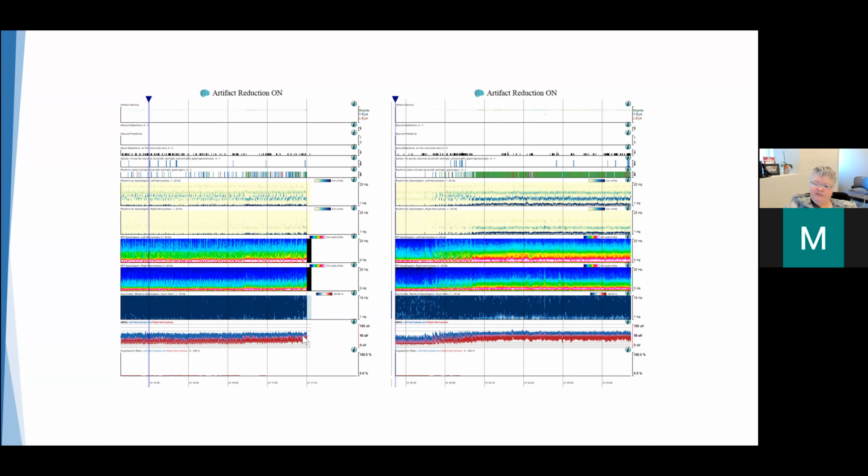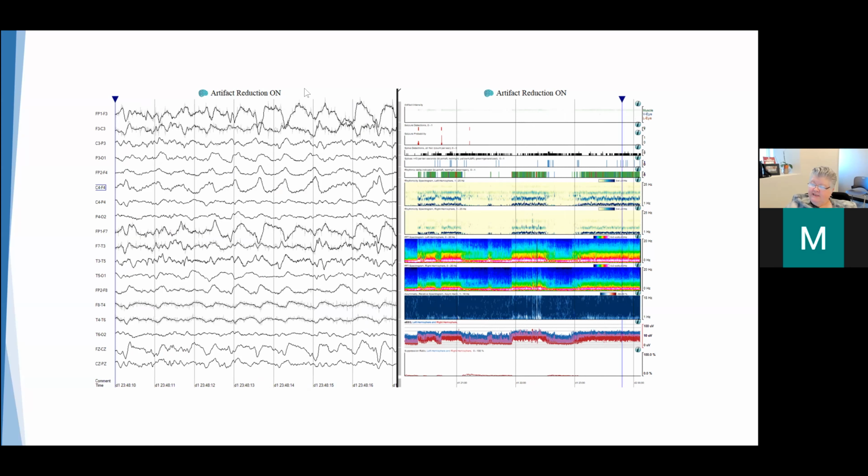If we look at what's going on in the raw EEG, we see increases in delta activity, so focal slowing over the left frontal and left frontotemporal region, some sharply contoured discharges here. And these changes, this rhythmic delta activity, occurred in bursts over time. Whenever the patient was stimulated, she would have these large increases in delta activity of the left hemisphere.